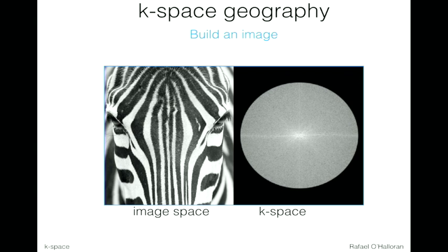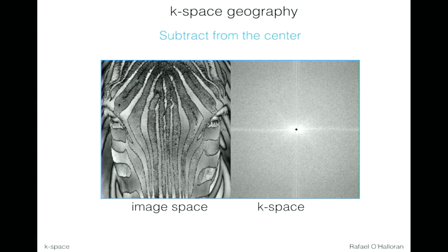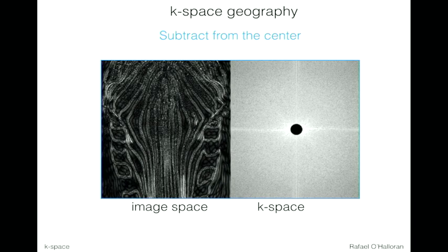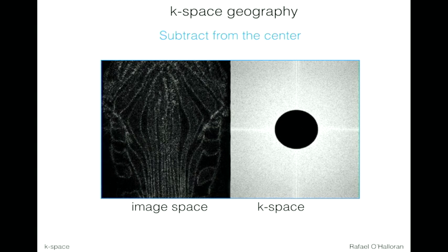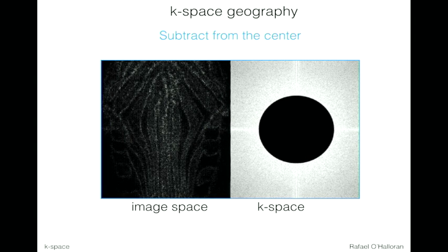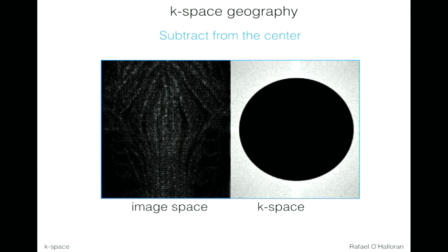And we can do this in reverse so that you can see kind of the opposite effect. Now I'll take away the center in a circular fashion moving outward, and you'll see what that does. So let's cut away the middle. So you see the contrast goes away, the large features go away, most of the general fill-in goes away, and then now you're just seeing the details, so the edges and the fine details of the image, which tells you that they're sort of out there in the edge where these really fine-grained stripe patterns are, which kind of makes sense.